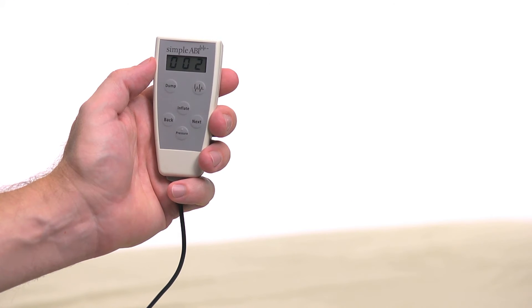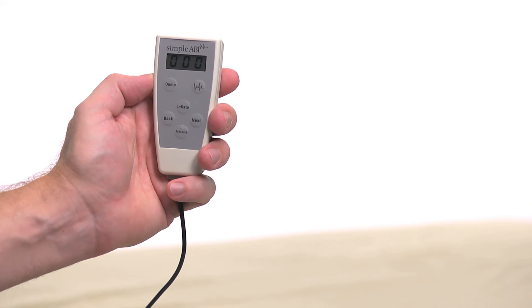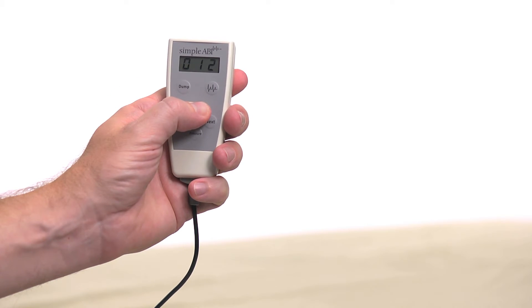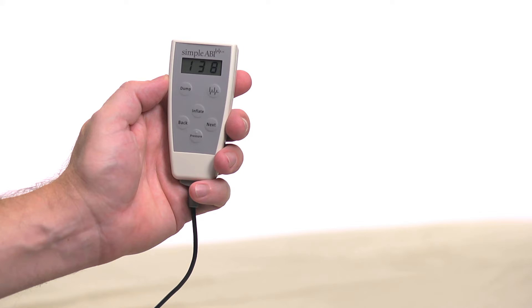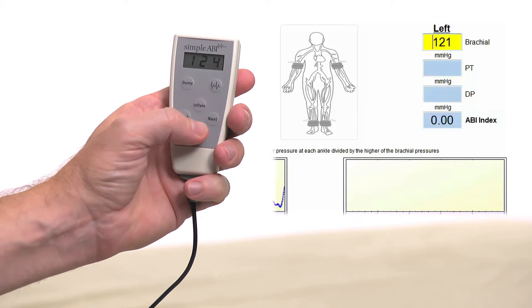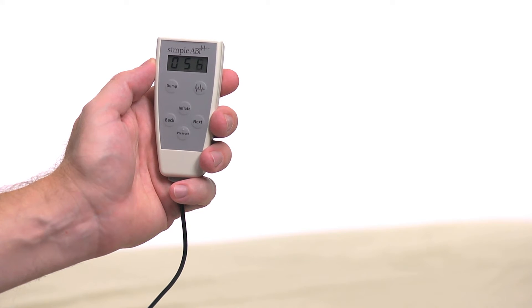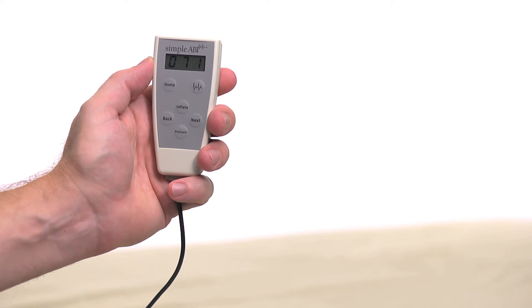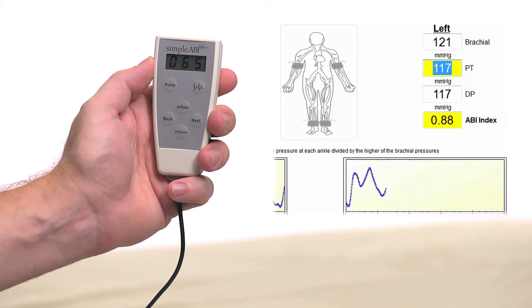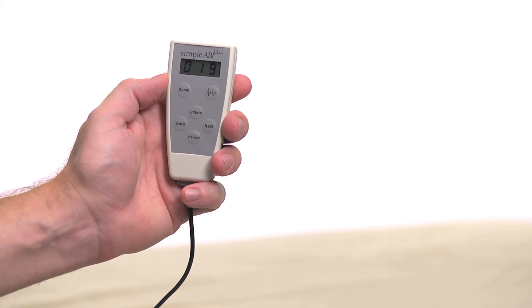Let's take a moment to learn the operation of the CuffLink remote. Next and Back are used to move between sites. Pressing and holding Inflate inflates the cuff; upon release, the cuff will deflate at a controlled 2 mm per second. Pressure is used to capture the pressure at which blood flow returns. The button with the waveform graphic captures a PVR waveform — it will inflate the cuff to roughly 80 mm and then reduce pressure to 65 mm to remove wrinkles from the cuff, then captures 5 seconds of PVR waveform data. Finally, Dump is a safety button that overrides other operations.